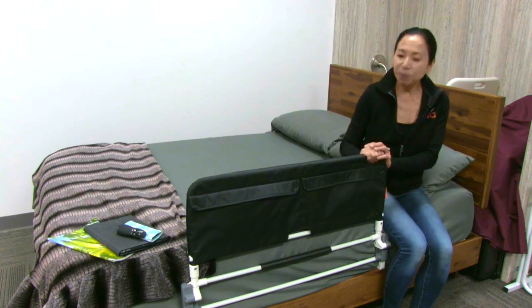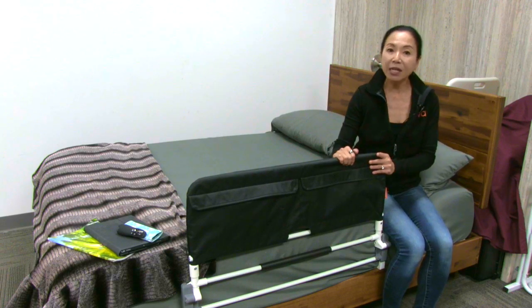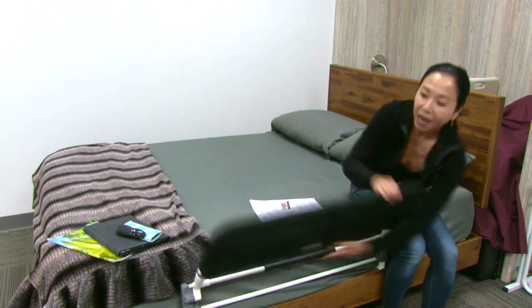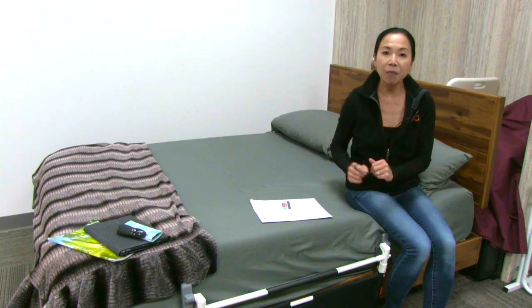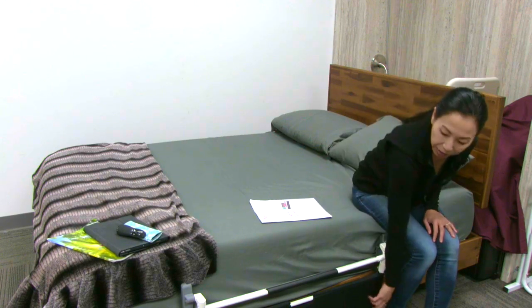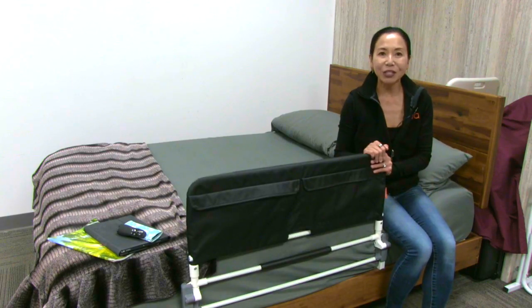This bed rail is so easy to install. The feature that's so great about this is the folding part. You simply pull up on this lever and the bed rail folds down. That's such a great feature so the user can get in and out of bed folding the bed rail down on their own, and it also makes it really easy for the caregiver. Then to use the bed rail, just click it in place just like that.